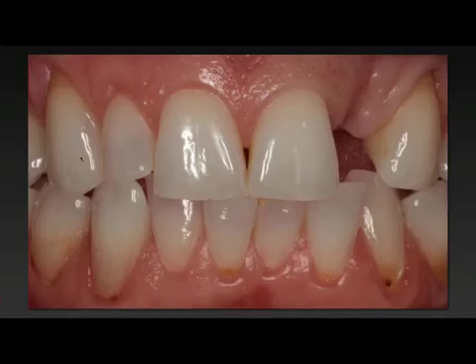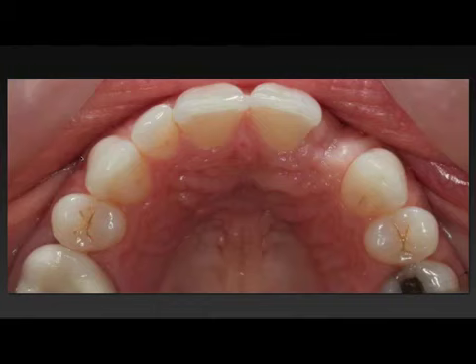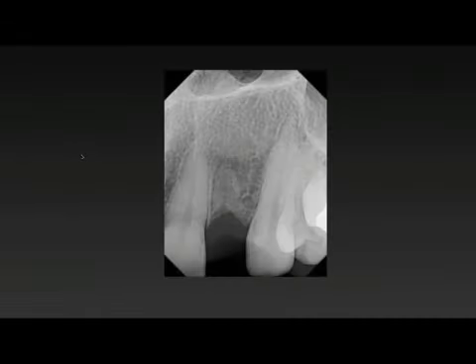Our next case is replacing a left lateral incisor that has been missing for quite some time, and the patient has been walking around with a flipper. There's a defect, but we found that this defect was mostly soft tissue. The bone was actually there, so we proceeded with the radiograph, which again the site was grafted previously, so that's why we had really no bone missing at all.